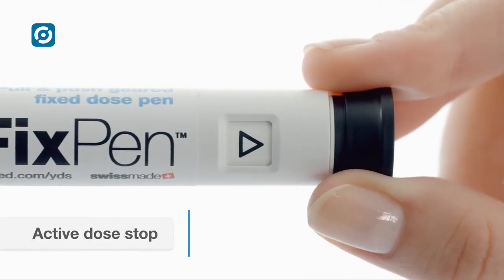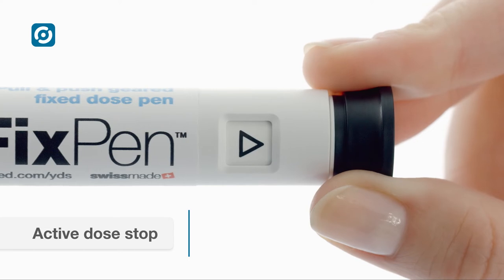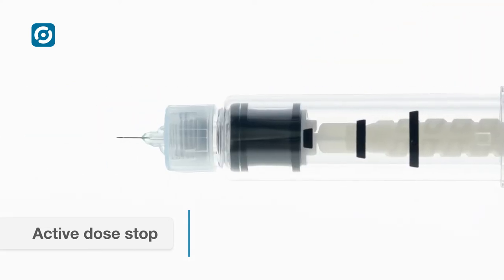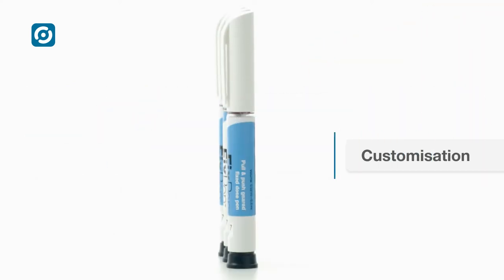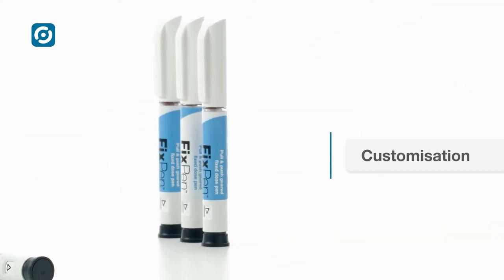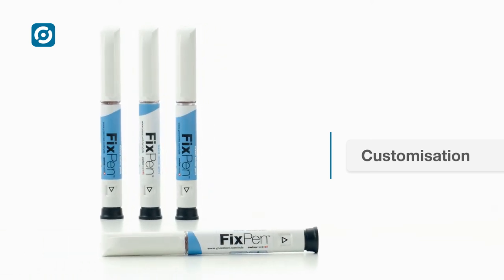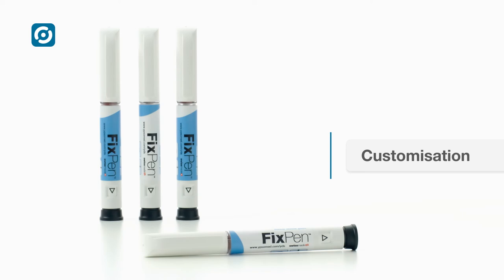The pen mechanism ensures that only full doses can be loaded, even when the cartridge is nearly empty. Pen color, dose size, printing and cartridge specifications are all customizable according to customer and therapy needs.